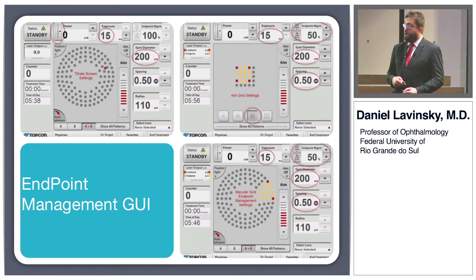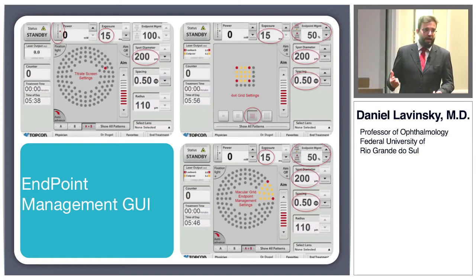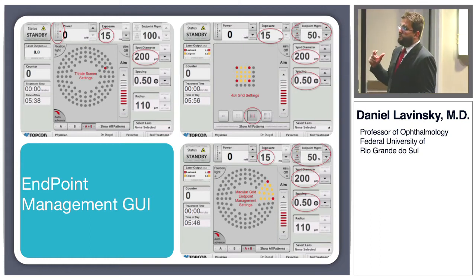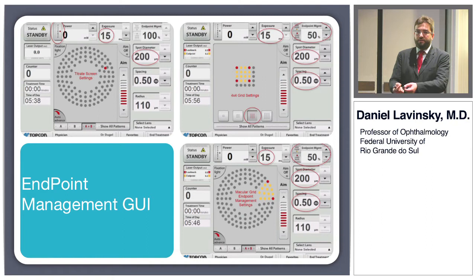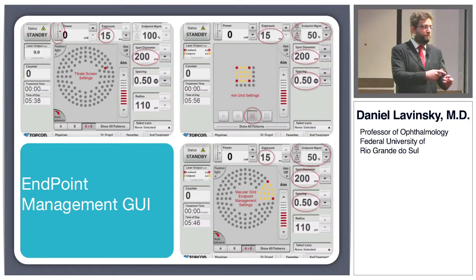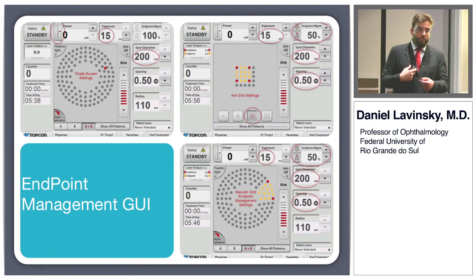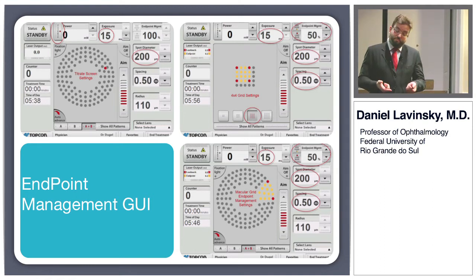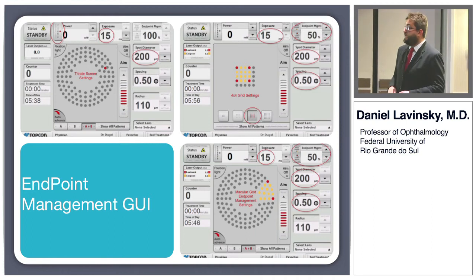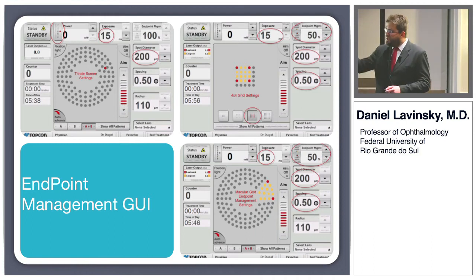We first titrate. And titration is one of the most difficult parts compared with other treatments like micropulse. I have a lot of experience with micropulse also. When we looked at the literature, it's all over the place. Some groups do titrate, some groups don't titrate, some groups have one dose fits all, so they keep 750 milliwatts for every patient. Some people, like we used to do, do a titration burn and increase the power by 20%. Why? That's the recipe that worked for us. And so that's really not very reproducible. That's the main criticism about micropulse, because the reproducibility of the treatments between groups is very low. So this we try to avoid.